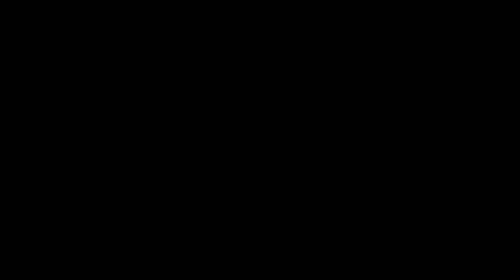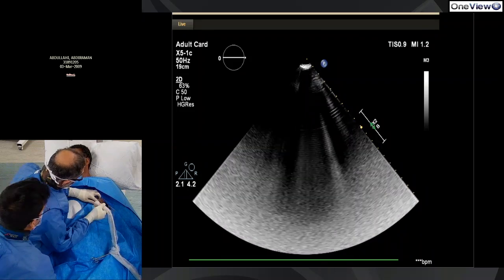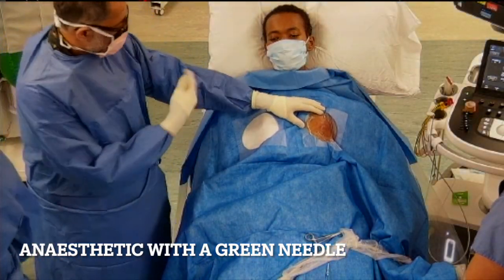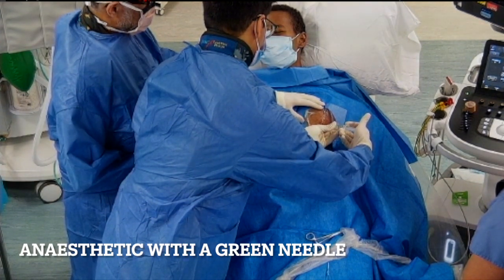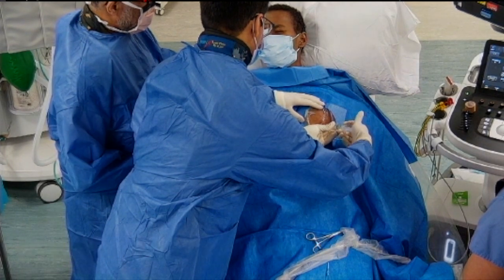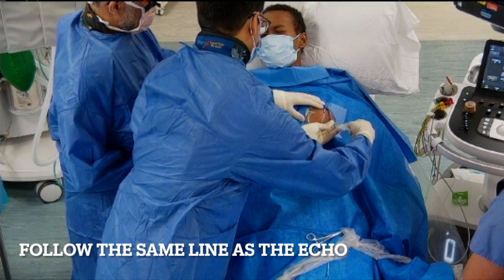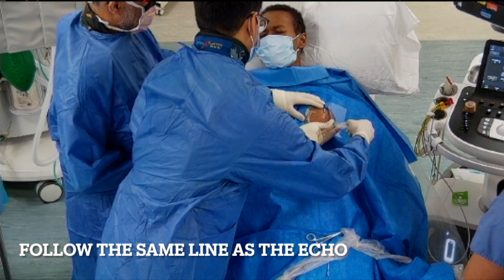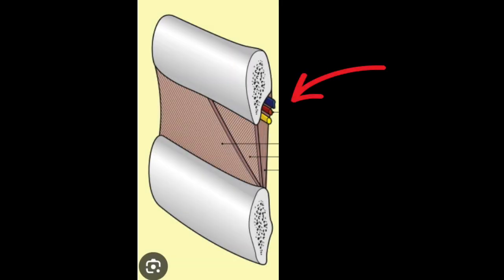Back with the ultrasound, this time under a sterile cover, so we can see the apical position and the fluid. The direction of the probe is also the direction of the needle. We take a green needle with anaesthetic attached, warn the patient about a bee sting, and my registrar pops in the anaesthetic on the marked position — just above the rib and not just below it. The neurovascular bundle runs just below the rib, so we avoid that area entirely.